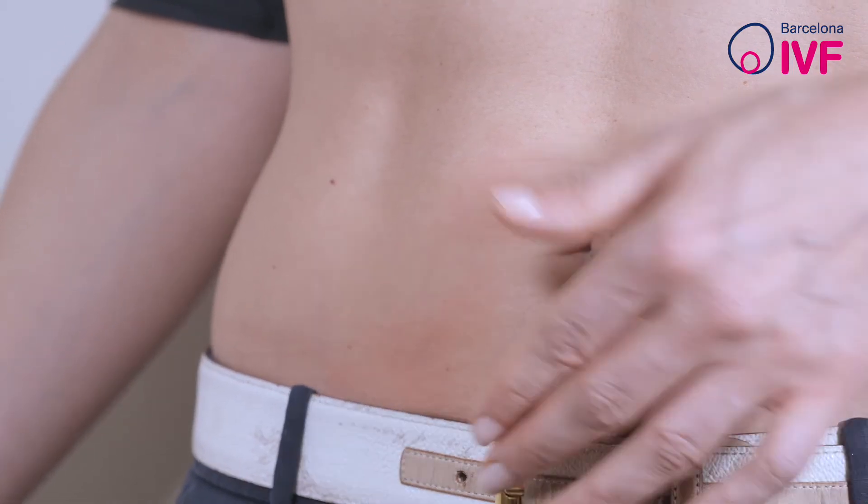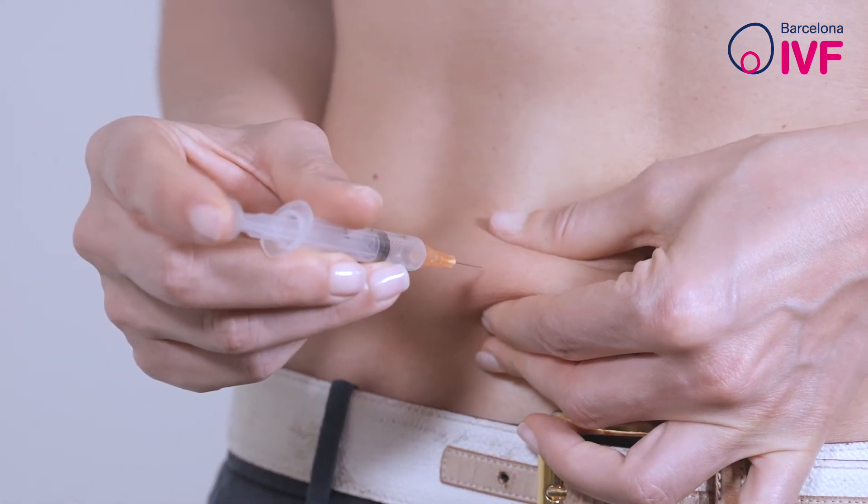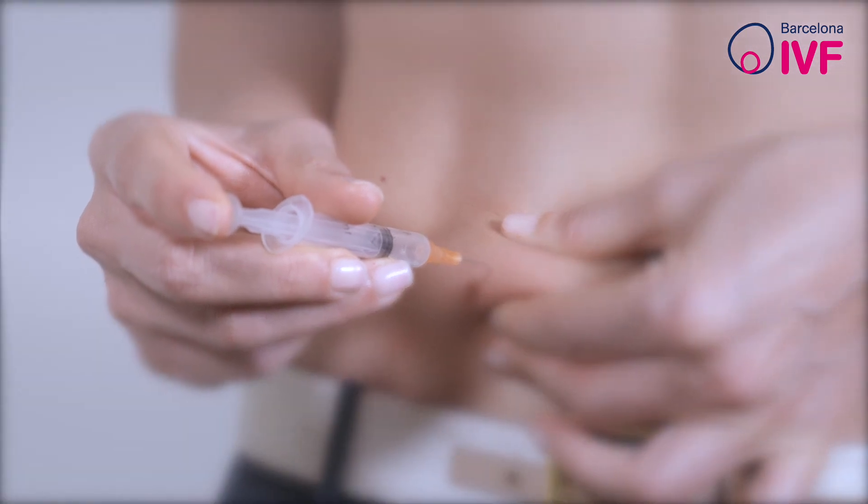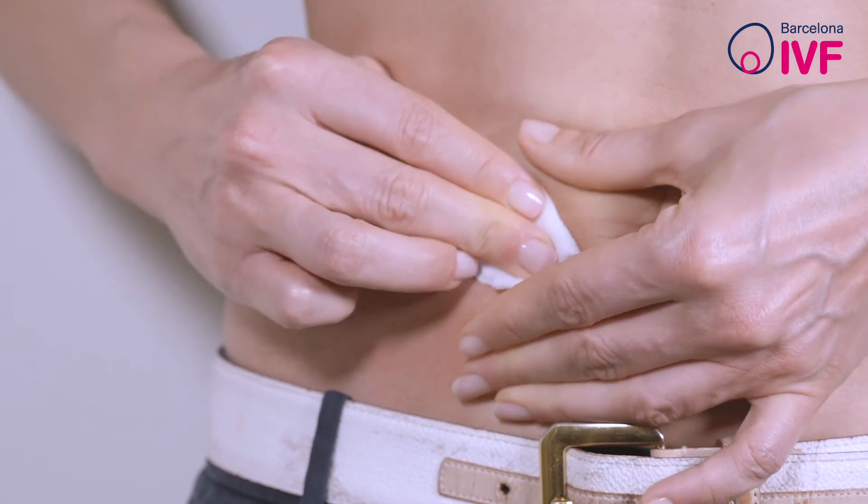With one hand, pinch the area of the abdomen where the medication is going to be administered, and with the other, take the syringe and insert the needle as perpendicular as possible into the skin. Push the plunger all the way in and then gently withdraw the needle and put pressure on the injection site for a few seconds.